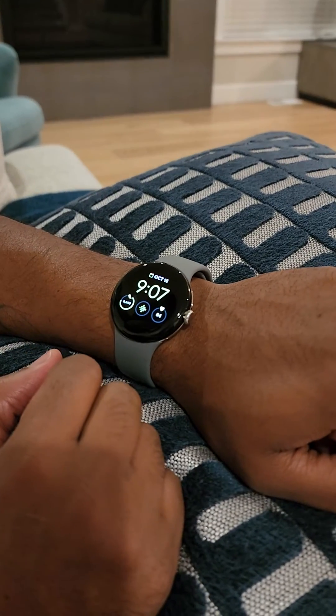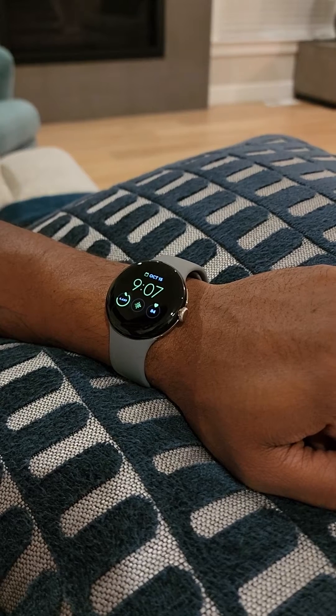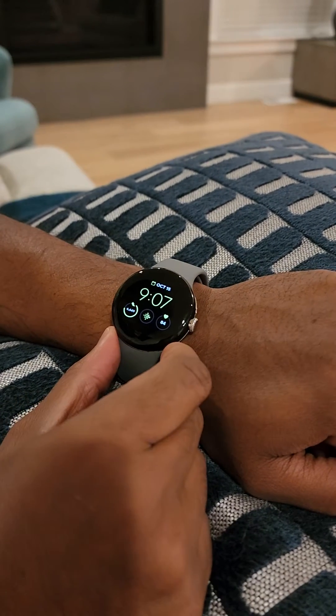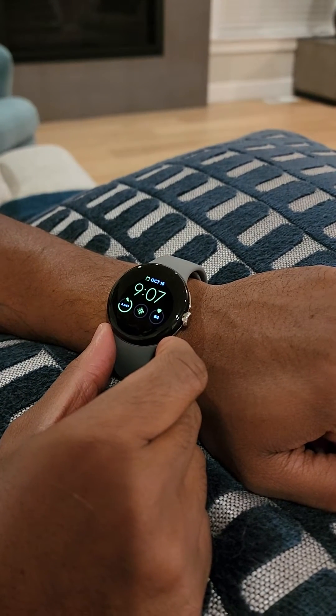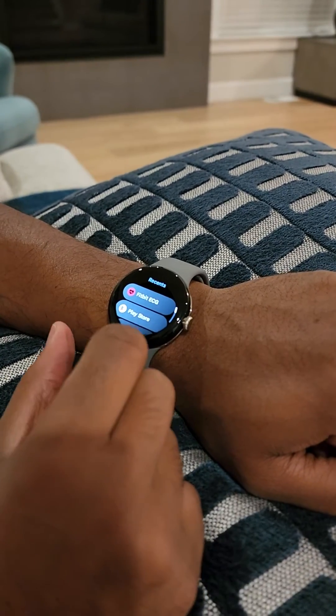Hey, welcome to the channel. Just a quick video. I didn't find the ECG app immediately on my new Pixel. What I had to do was actually go into the Play Store, and I will show you what I did.